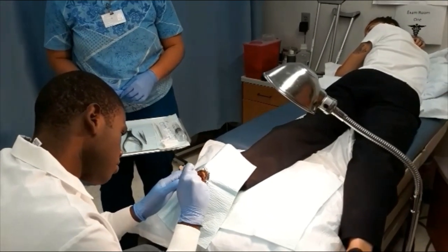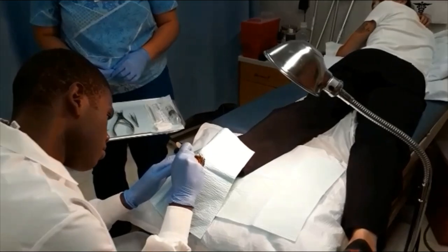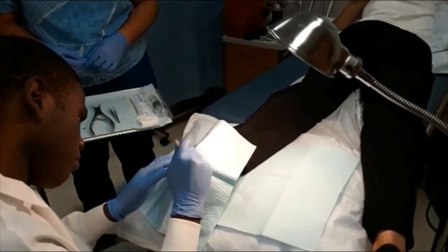The scalpel is then used to cut around the outside edges of the wart for easier removal.